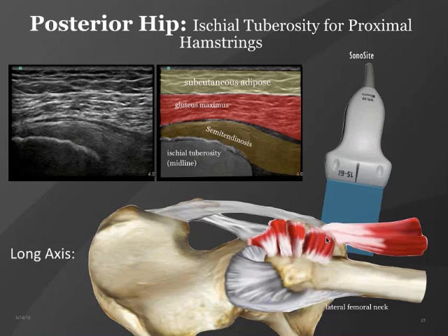These 2 or 3 tendons come off from a conjoint origin and travel distally. Here on the diagram, you see the conjoint tendon, the glute maximus, and the subcutaneous adipose tissue corresponding to the ultrasound on the left here. And here's the ischial tuberosity, there's the conjoint tendon, and this is glute maximus. Remember now, this is a long axis view, so this is the anatomic sagittal plane.